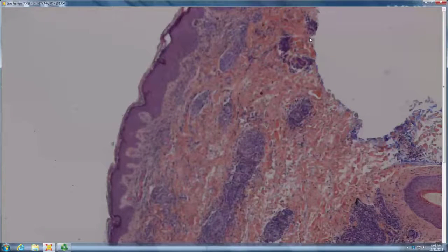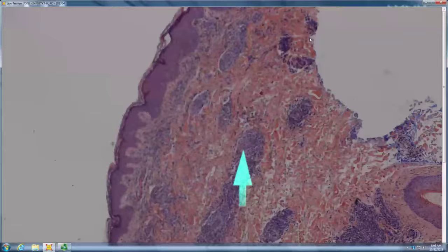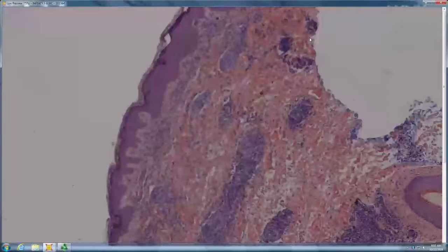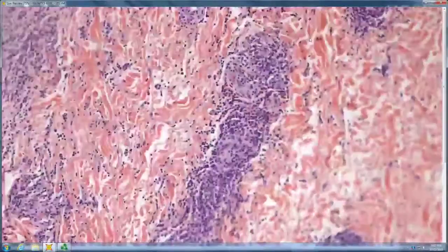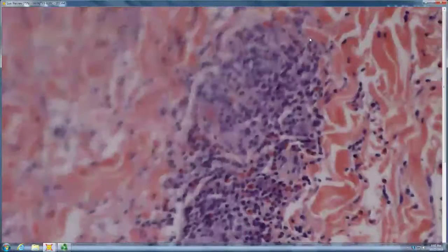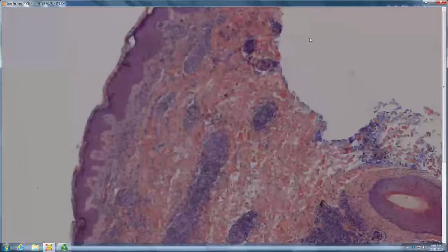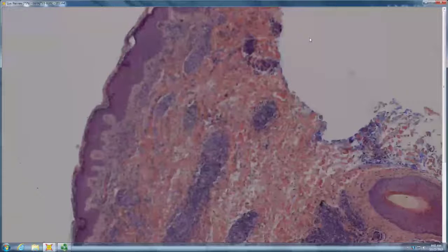Superficial inflammatory infiltrate and then some tight. Just superficial or perivascular? Superficial and deep around the vessels. And then the lumen of the vessel? Can't see them. What are all those big plump gray cells where the lumen ought to be? Probably histiocytes. Swollen endothelial cells, right? So swollen endothelial cells, tight perivascular lymphoid infiltrate, any other kind of cells present? Eos. So you're favoring what for this? Angiolymphoid. Does that tend to give endothelial swelling with hobnailing? Hobnailing.